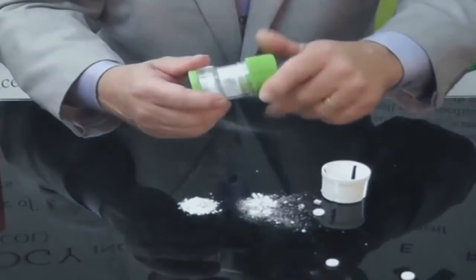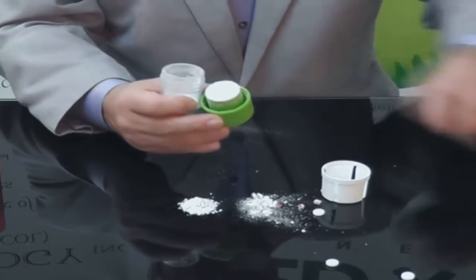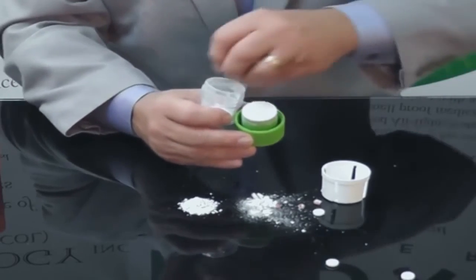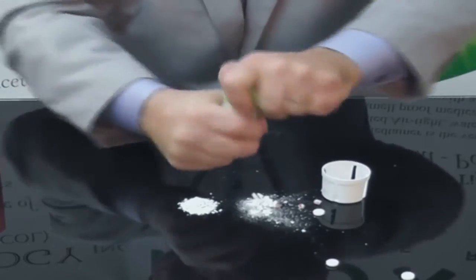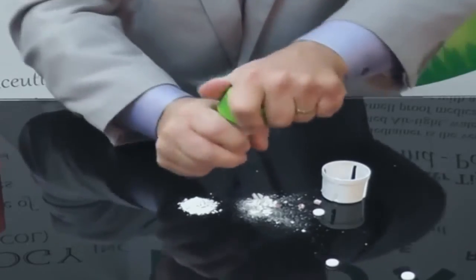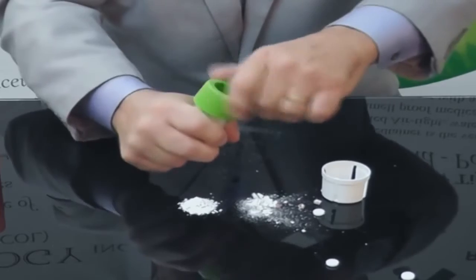This is a commercial pill grinder. It has these little grinding teeth. We've used this a bunch of times to make certain that we get the testing protocol correct. We'll put the same amount of medication into the pill grinder. And then again, we'll use the same amount of time, 10, 15 seconds, and we'll see what kind of consistency we get with a pill grinder.